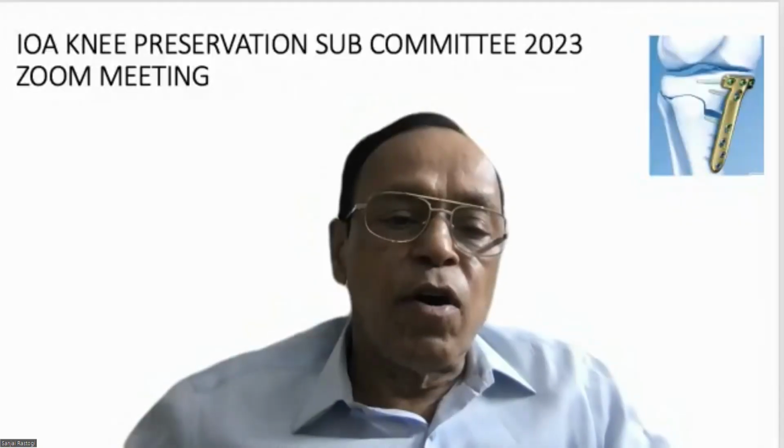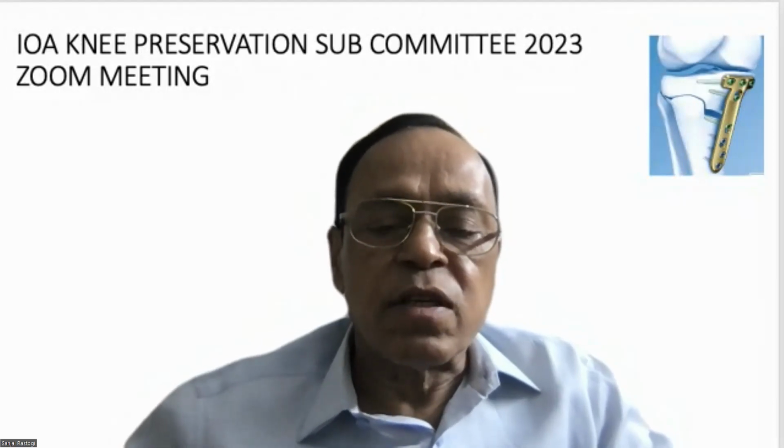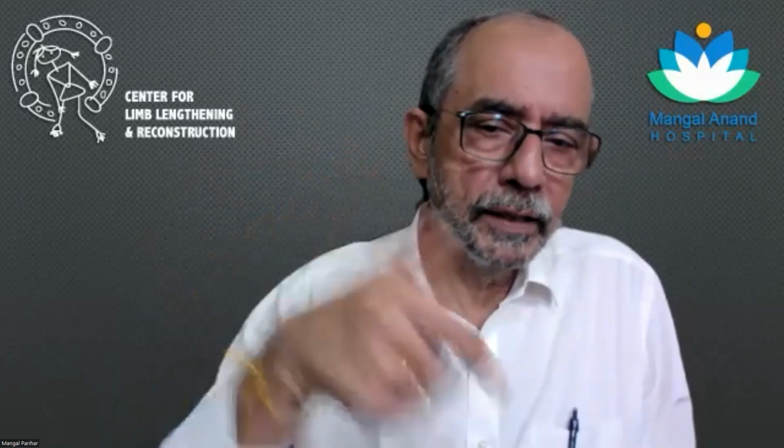There is a workaround. The other method of not perforating the opposite cortex, which I've learned, is that you only drill the proximal cortex. The rest of it, you just push a little bit through the cancellous bone. There is that woodpecker sort of method. You drill and push, drill and push, till you reach the opposite cortex. And that works pretty well.